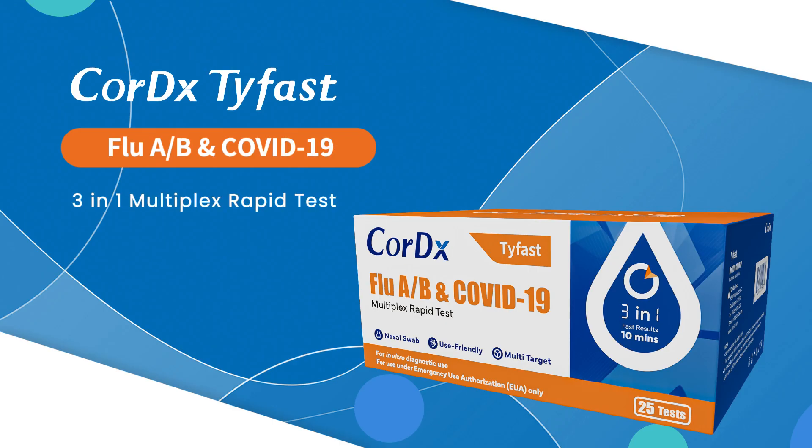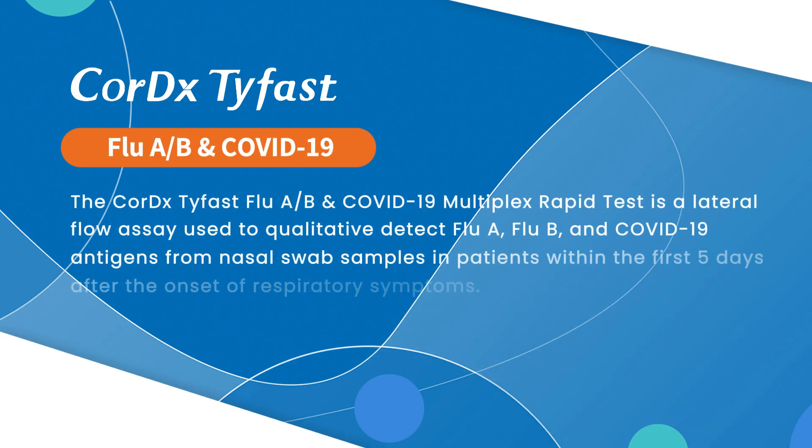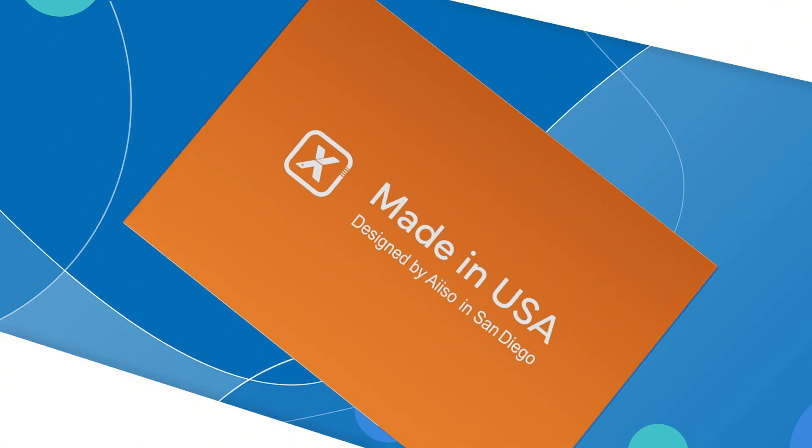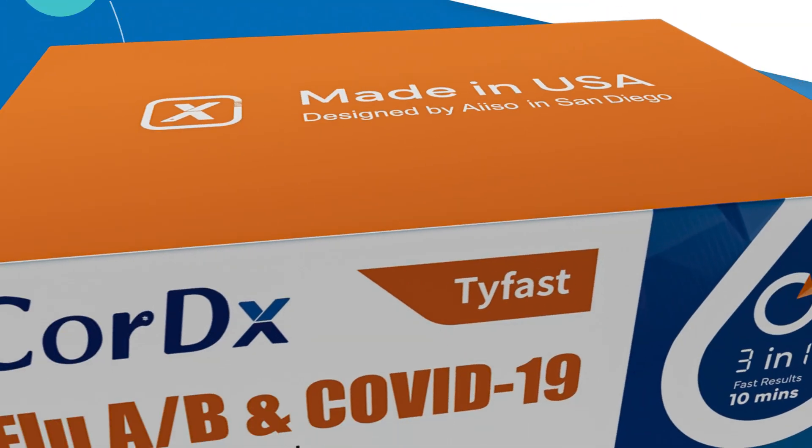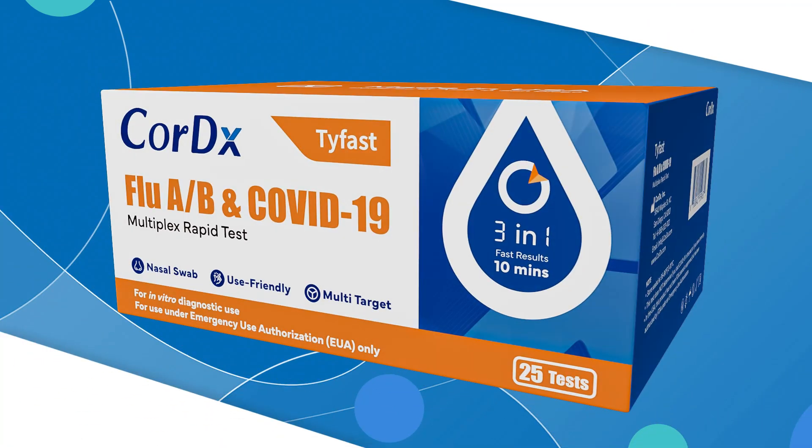The CorDx TyFast Flu A, B, and COVID-19 3-in-1 multiplex rapid test is a lateral flow immunoassay intended for the qualitative detection and differentiation of SARS-CoV-2, influenza A, and influenza B protein antigens. Each box of CorDx Flu A, B, and COVID-19 multiplex rapid test contains 25 tests.